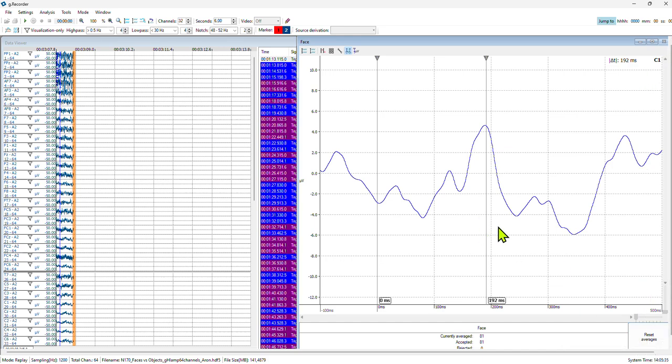If you do it by the end, then you won't have a very nice evoked potential, because you will be seeing just a few trials. So this is the visualization tool. It will just start printing from 0, from scratch. It won't erase those trials, so you will have all of them available for the offline analysis. I hope this helped.